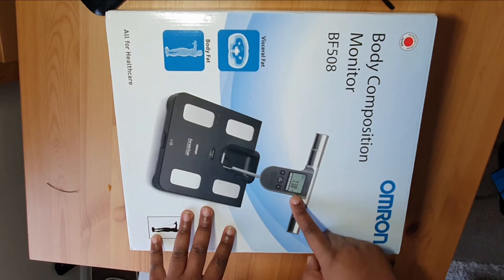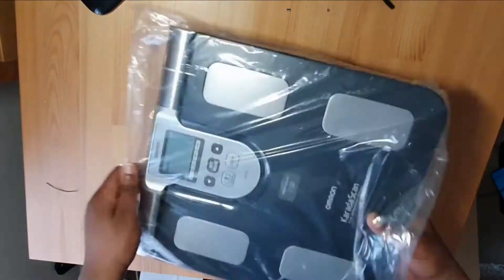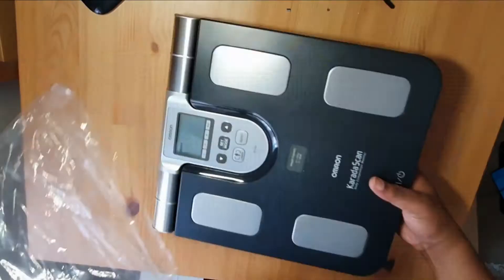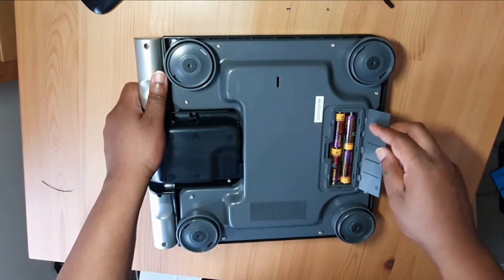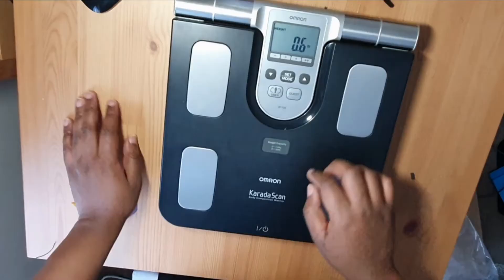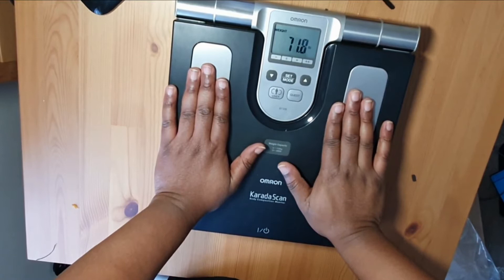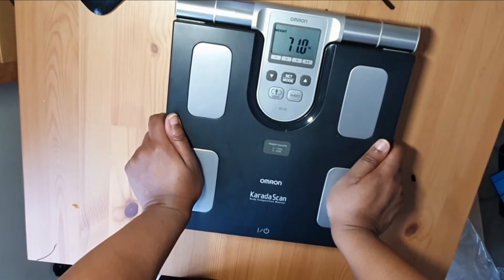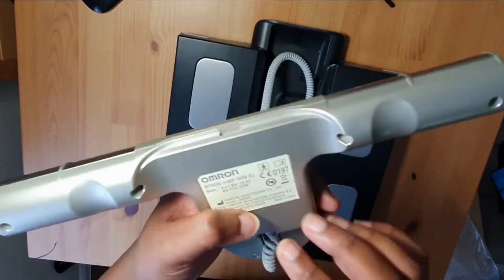The problem with this is a faulty display, so we're going to open this up, have a look and see what we can do. It's been given a very good clean — it's in exceptional condition, really really good. I'll be lucky if I get the batteries, but look — the batteries are included! We can already see some digits acting very very strange when weight's put on it. So it's down to a faulty display — let's see what we can do and open this up.